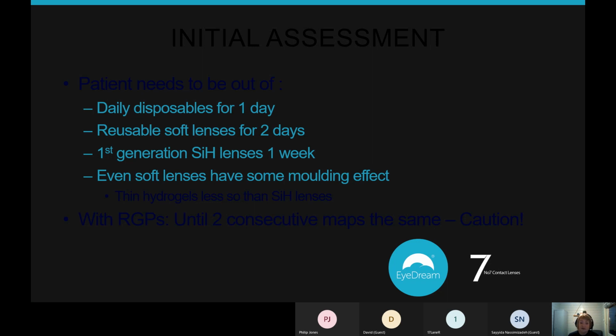If you look, you'll be able to find case records of patients who, back when we were fitting these lenses more for extended wear, wore an inside-out Night and Day for a week or so and actually lost about 2 diopters of their myopia, so a silicone hydrogel ortho-K effect, and they lost it because they wore the lens inside out. When you put an inside-out Night and Day in and put some fluorescein in, you actually see the ortho-K pattern, the creation of a reverse geometry ring, so you can see how it could happen. In some ways, it's a shame that we haven't been able to manipulate that and make ortho-K potentially monthly disposable, but unfortunately, it's not predictable enough to do that.